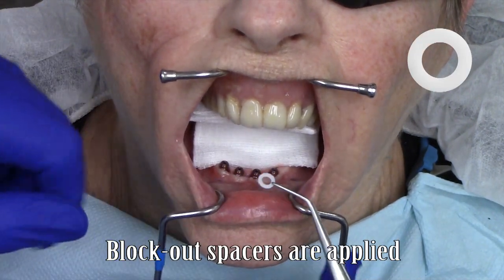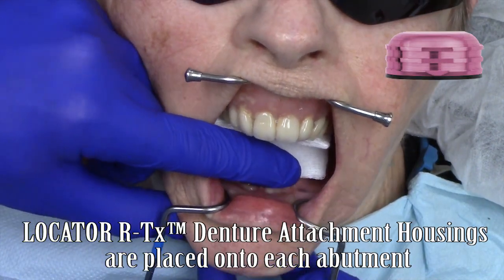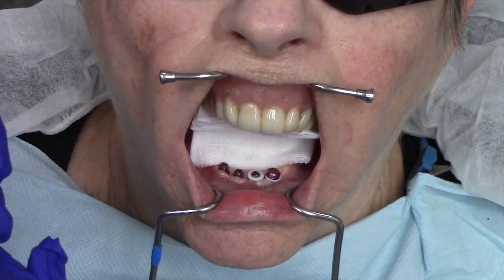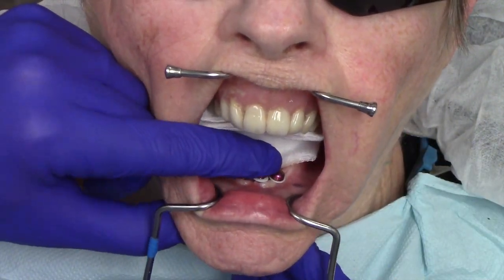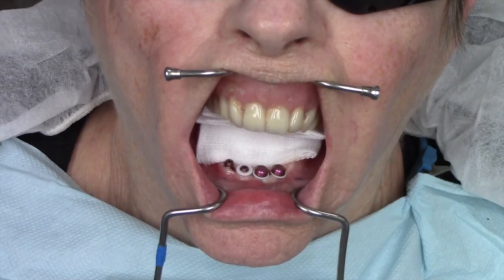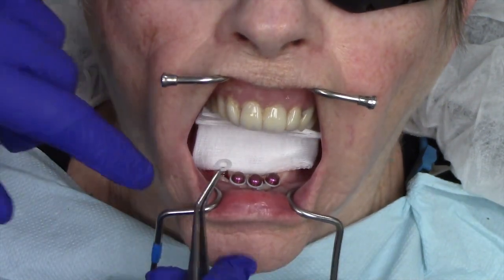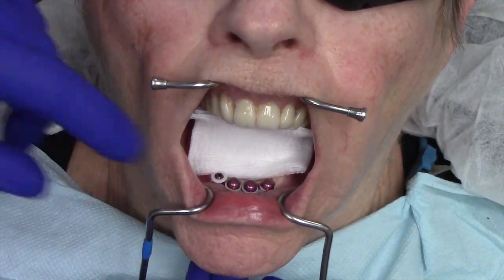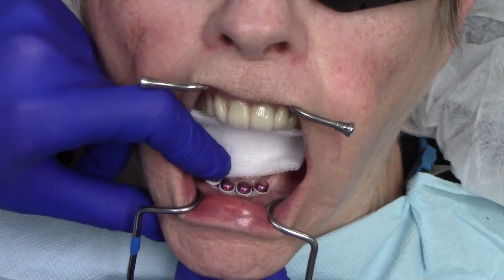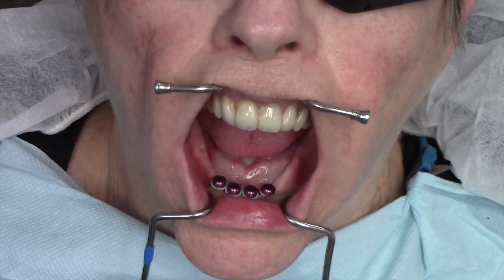The block out spacers are applied to the top of each of the locator RTX abutments, similar to how you place them on top of a standard locator abutment. The denture attachment housings are placed immediately on top of the locator RTX abutment, compressing the block out spacers slightly below the housing. I very carefully take that block out spacer and lightly apply it to the top of the abutment, then take the denture attachment housing starting at a 45 degree angle and push in a diagonal fashion until it seats completely. I'm also placing a throat pack behind the implants to ensure that the loose parts don't go missing.